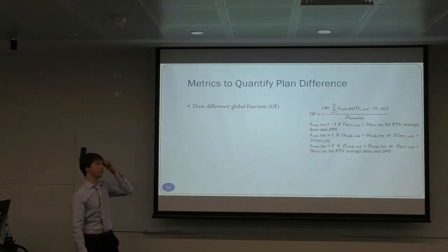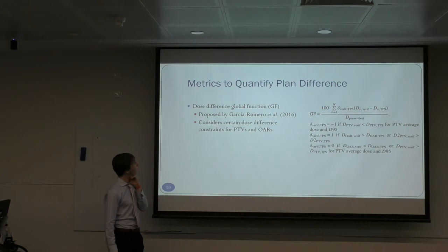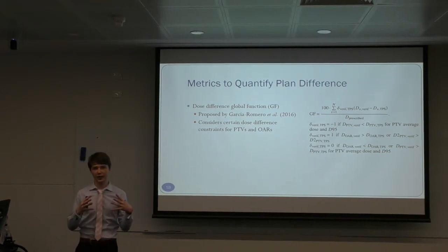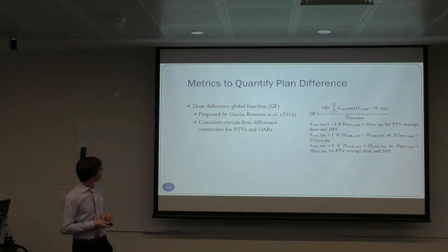One more metric, the dose difference global function. This was developed last year by Garcia Romero and others, and it's a way of considering a lot of different dose parameters. Hard to explain.